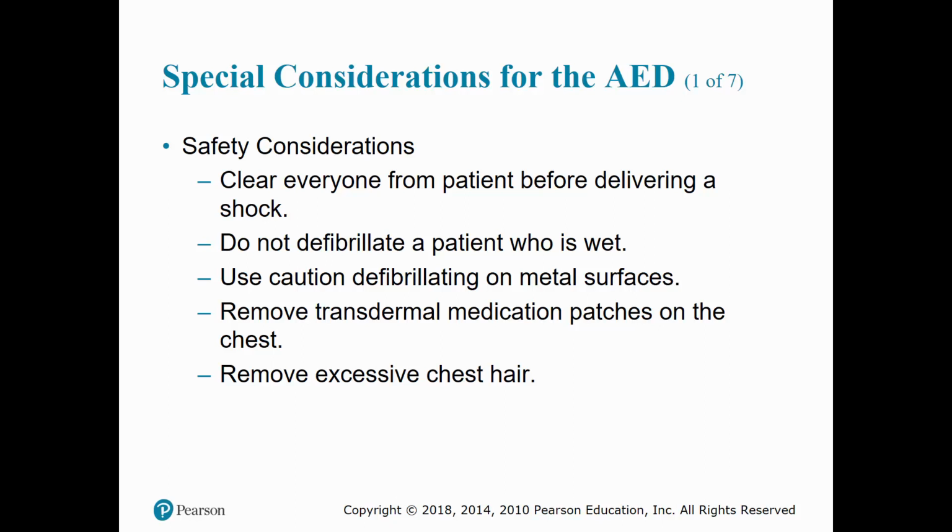Safety considerations. Make sure everyone is clear from the patient before delivering the shock. Do not defibrillate a patient who is wet. Use caution defibrillating on metal surfaces. Remove transdermal medication patches on the chest. Remove excessive chest hair.